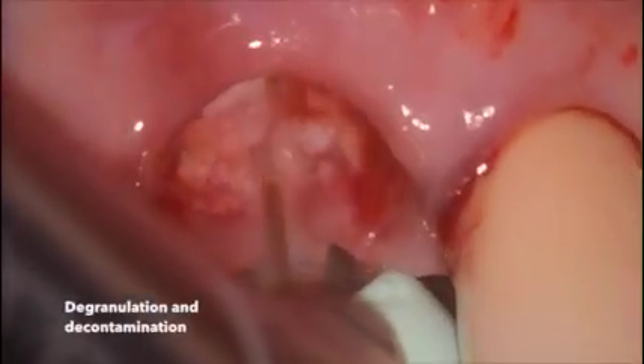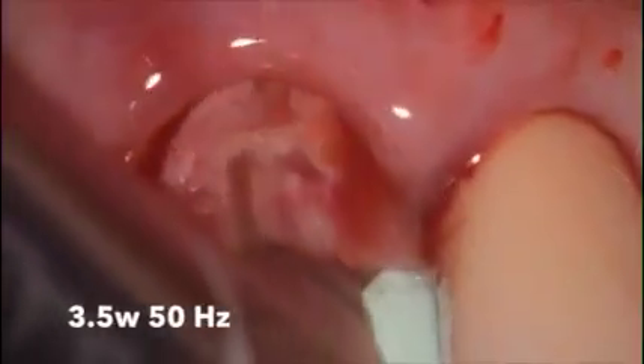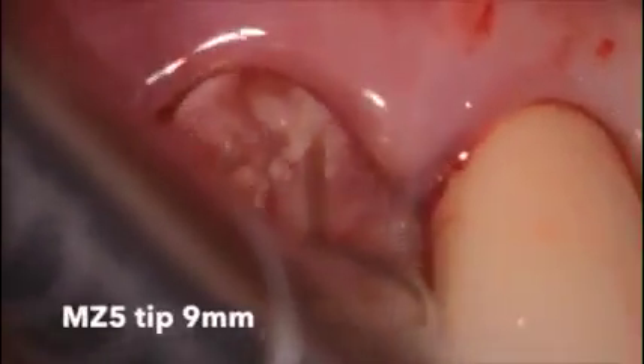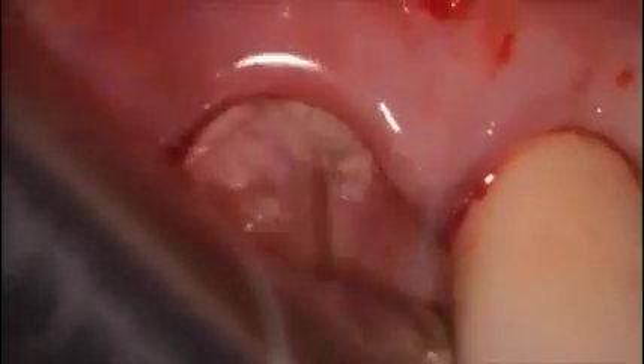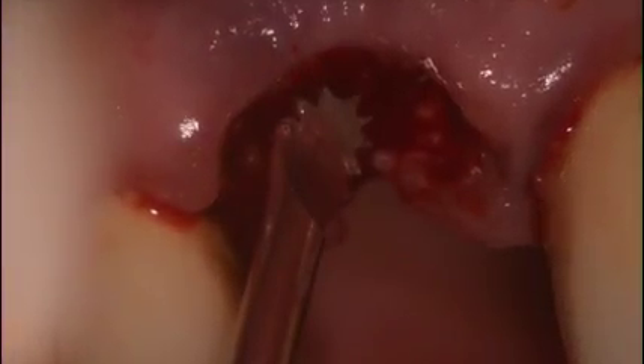Dr. Ed Cusick has done some nice research on this. You can see the tooth that was remaining, and here we see some soft tissue at the cuff of the tooth that we're removing gently with the laser — three and a half watts, copious amounts of water, 90% water, 80% air — just removing any of the granulation tissue in the socket that remains. In addition to using the laser, I often use a serrated curette from Dewell, which helps to remove any of the granulation tissue within the socket. Magnification helps immensely to see inside the socket and verify that it is clean.